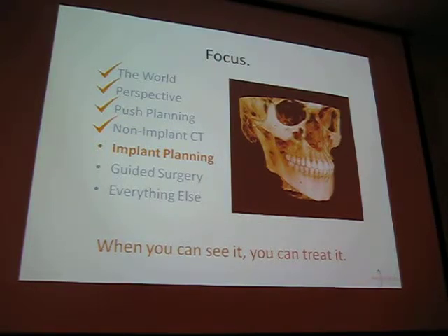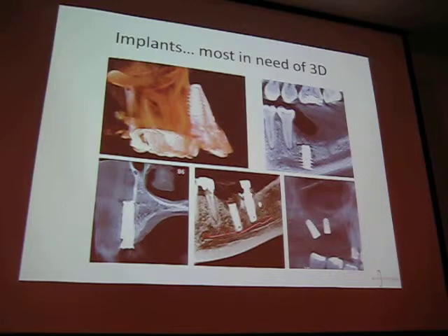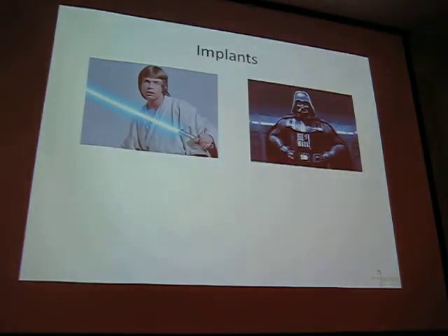To get to the implant planning, which is really where CT shines, and it shines for good reasons and bad reasons. Implants are really great, they're really scary, right? This is the only scary part of the program, besides that last slide.